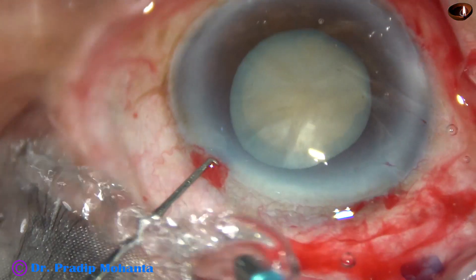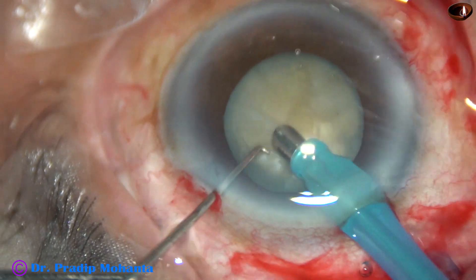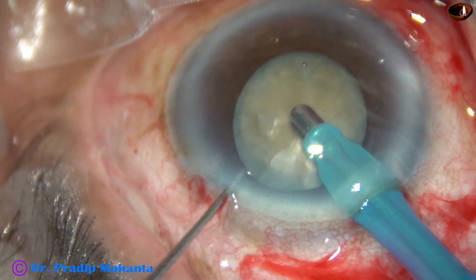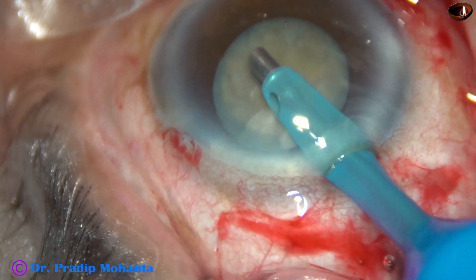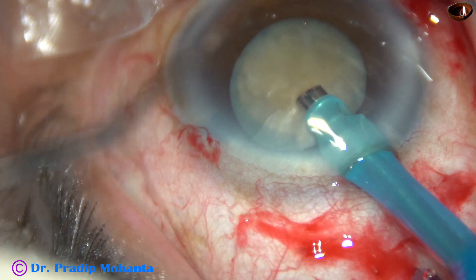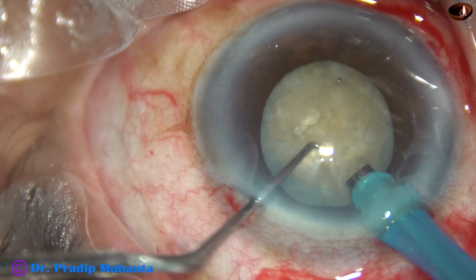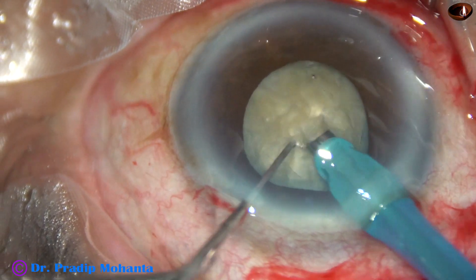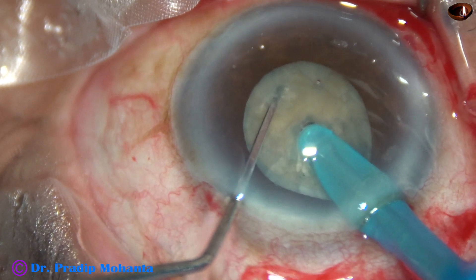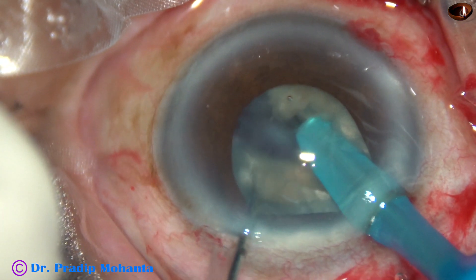This is a phaco machine from Oertly, Switzerland. The tip of the phaco handpiece goes bevel down. Some superficial cortical lens matter is removed. And now I turn the handpiece, make the bevel up. And now — this is not submarine chop, this is trench and chop. The tip has been buried into the substance of the nucleus.